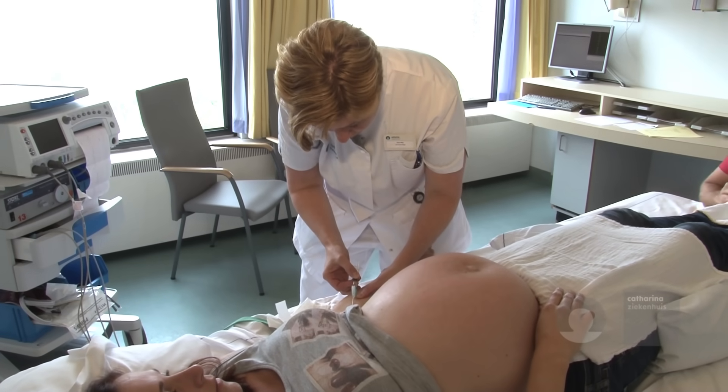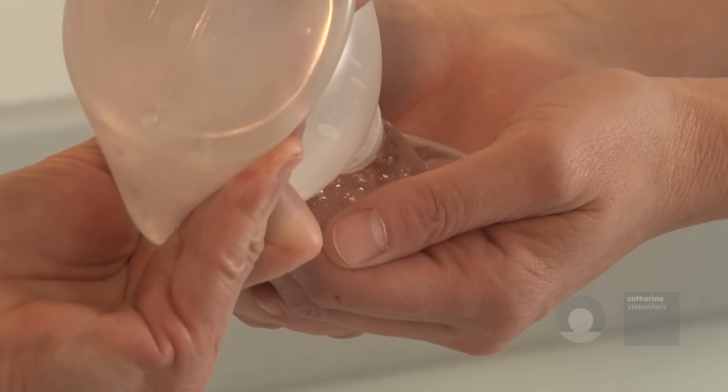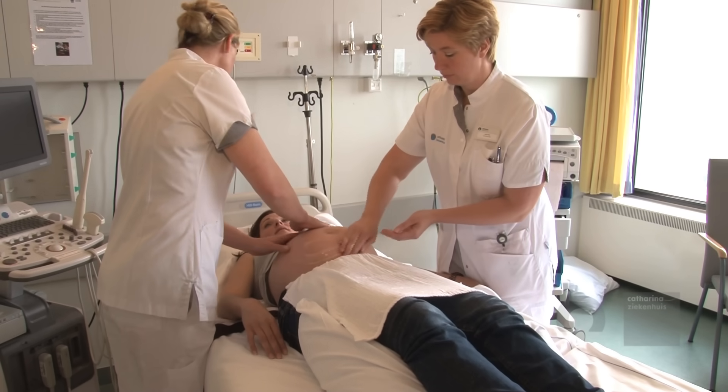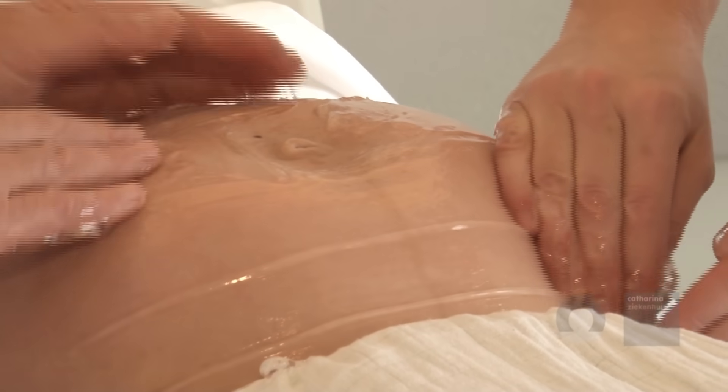An intravenous injection with tocolytics is administered. A warm ultrasound gel is applied to the mother's abdomen. Two obstetricians perform the ECV as they are working as a team.